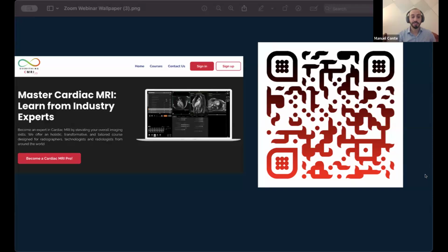Yeah, my answer is it depends on the low field. For example, the scanner that we have is an open scanner, 0.5 tesla, but there are no parameters for metal artifact reduction.